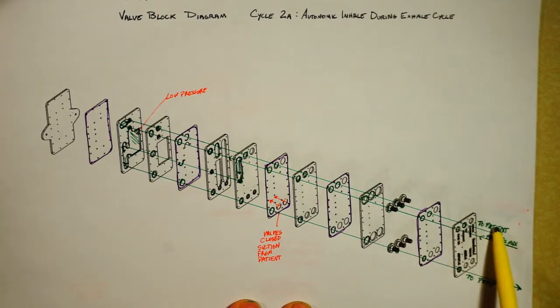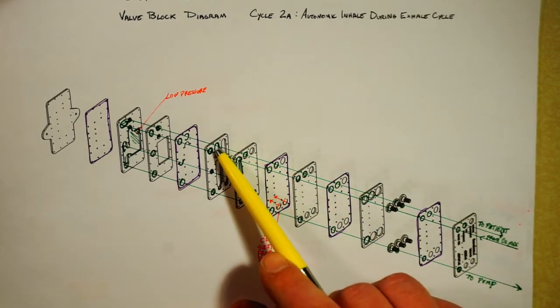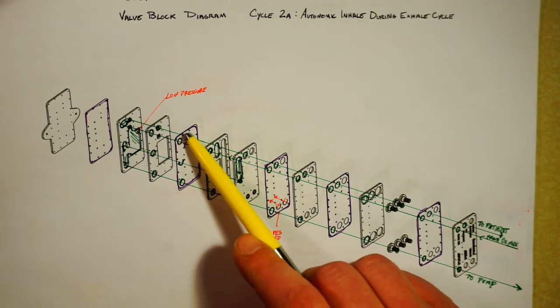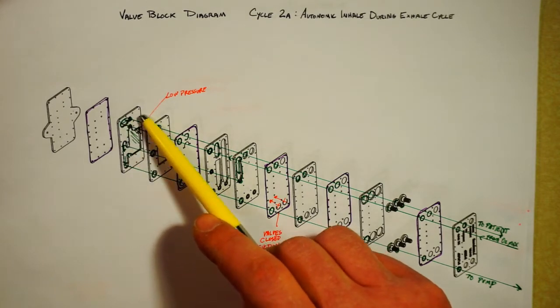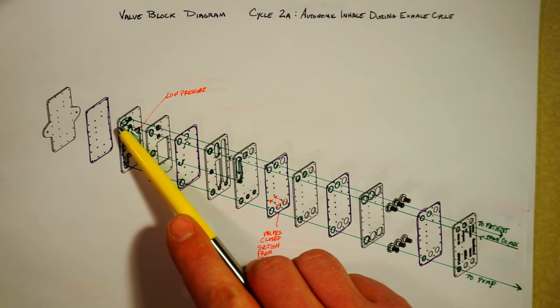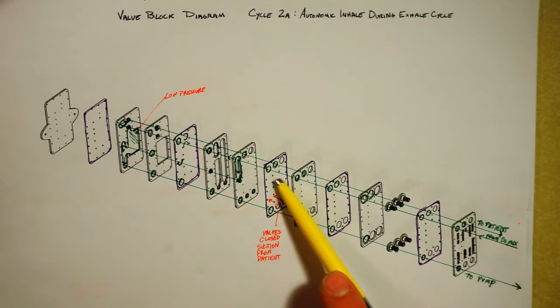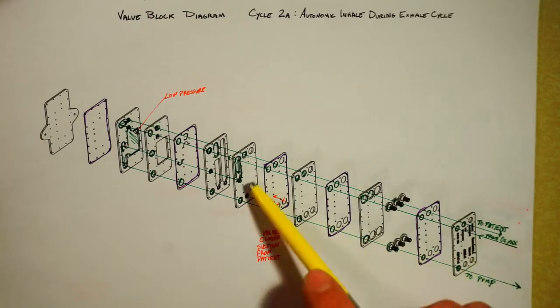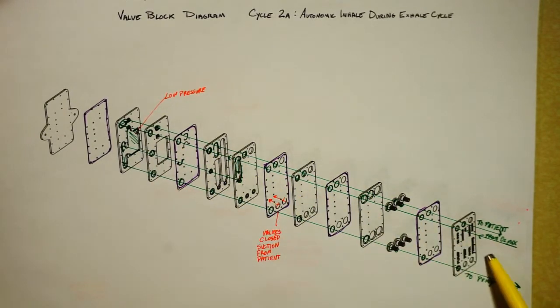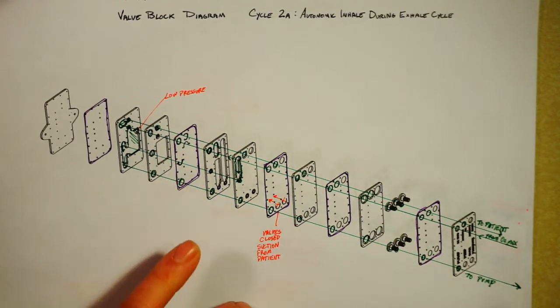But the patient creates a suction on the to patient port, which enters this chamber. Pulls this check valve up, opens this port to this chamber. This chamber is then connected directly through these holes to the air in or O2 mix. So the patient can breathe around this entire system while the pump is inhaling and the patient should be exhaling.